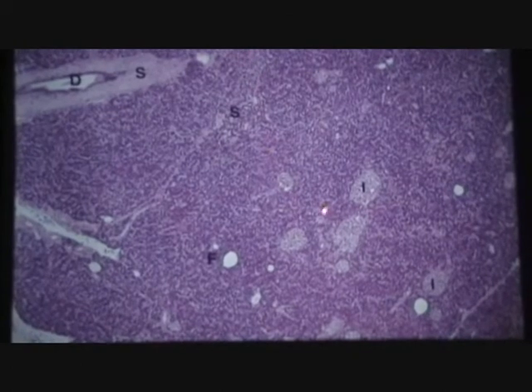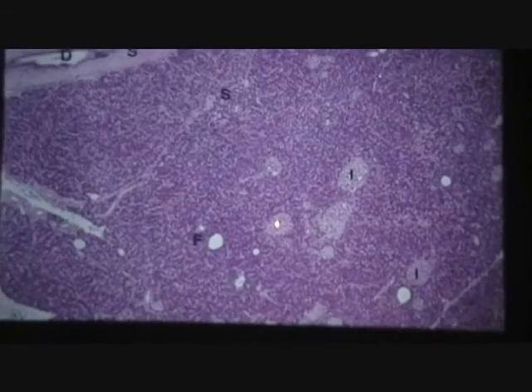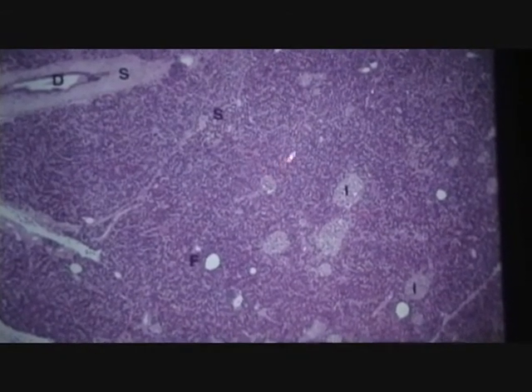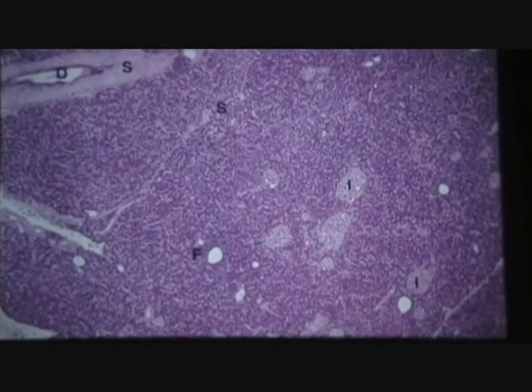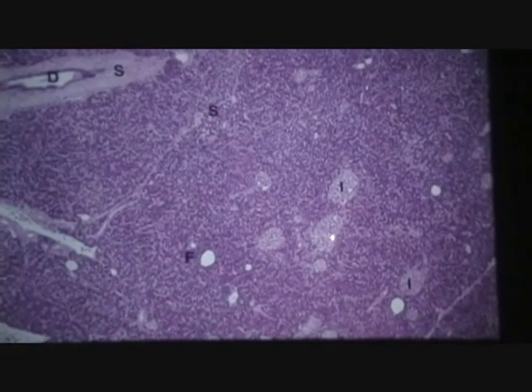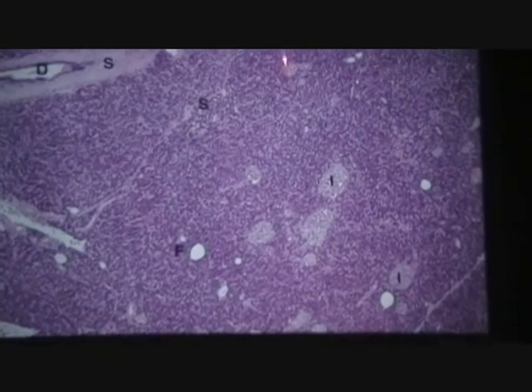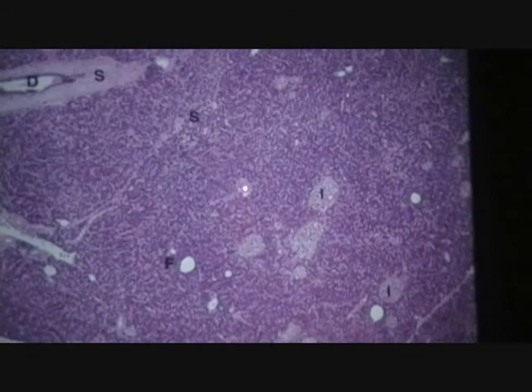Does the term textural shift strike you here? Little differences? So what are these? These are islets. And I would tell you this is the toughest you'll ever see. And you're really counting on this textural shift in the tissue. Little islets, all of these. Say parotid obviously doesn't have those, so this has to be pancreas.